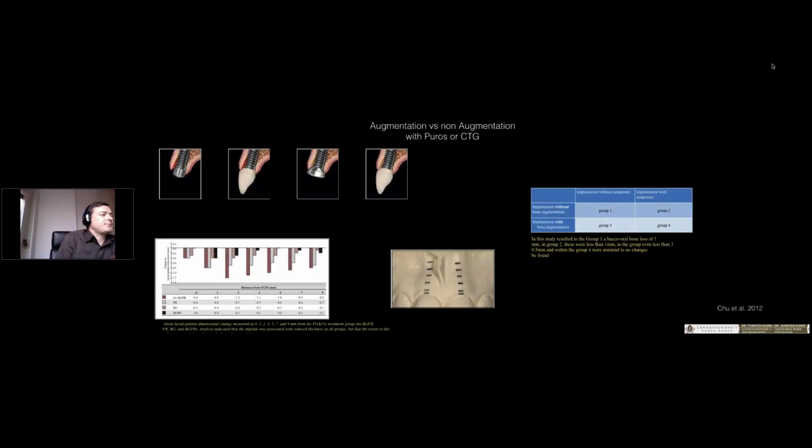So the next slide shows a very new study. It is very interesting: how does the buccal bone react if you make a dual zone augmentation? I will show you in some slides after this what dual zone is. Dual zone means we make our augmentation with human bone. You can take it from the case itself. If you have a drilling, put the drilling bone outside without using cooling. My protocol is to drill inside the bone with only 40 up to 50 rounds per minute and using no cooling.